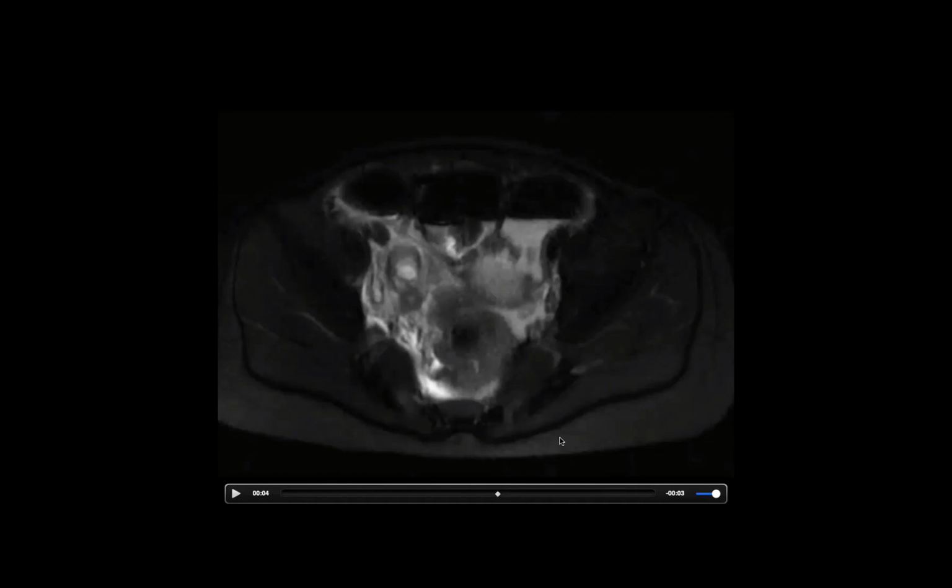In fact, I'm not 100% sure, but I think on these images the readout direction is right-left. The phase encoding is AP, right? And so you notice that in the readout direction, you don't see it so much on one side. You see it more on this side. But then in the phase encoding direction, it's even more prominent, right? So that doesn't make sense. Yeah, I wonder what exactly is going on here, but I think this is a chemical shift issue.